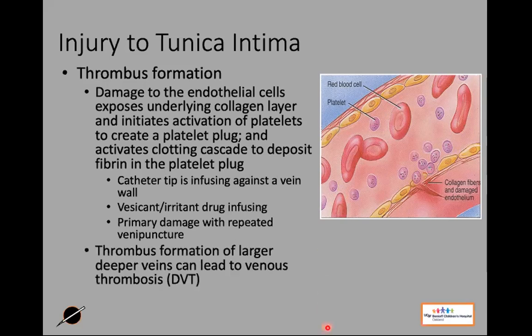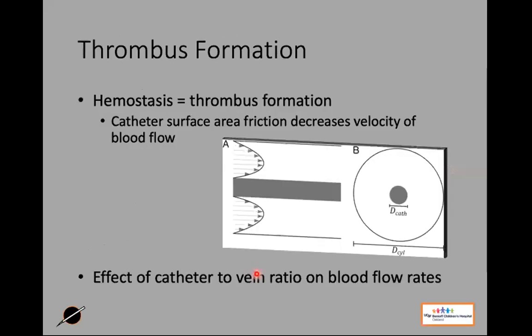Okay. All right. And if we do see this thrombus formation, it has the potential for becoming a DVT if we're in a deeper blood vessel. Okay, so thrombus formation, and this is something I want to think about, especially for us in the ED. You know, we like to go big or go home. We like those big IV catheters.